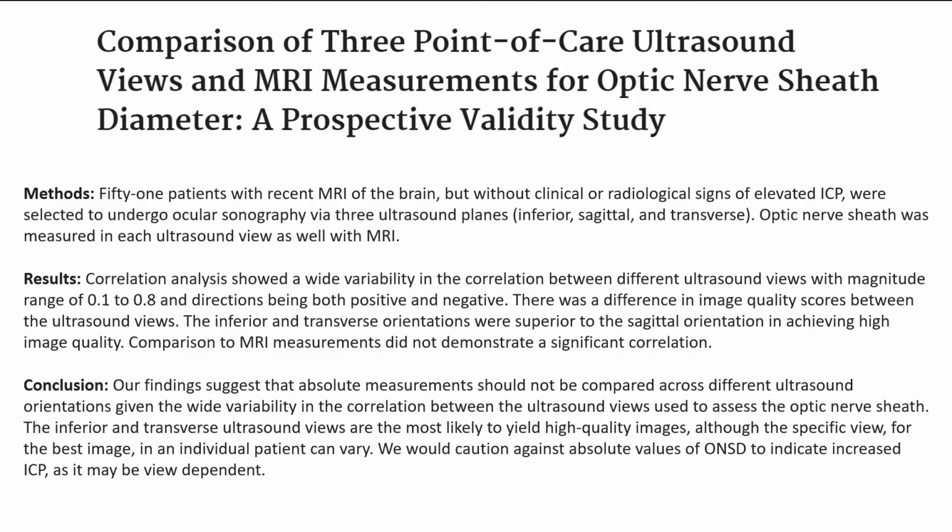So how do I view this particular paper? Do I see a disparity? Well, again, this is in healthy individuals. The pretest probability might be lower, actually is lower in this patient population, but there is value in this paper in that this is where we get the thought that we should be taking our measurement in multiple different planes and views to get a more accurate global measurement and assessment of our patient.